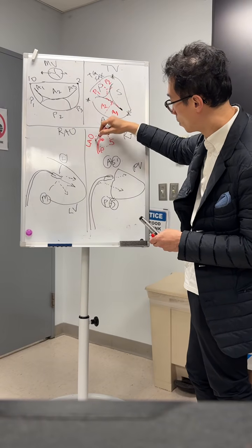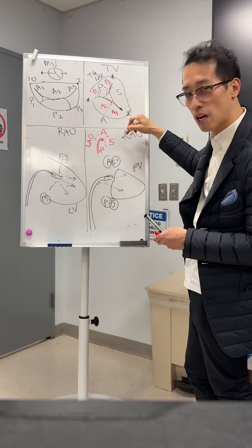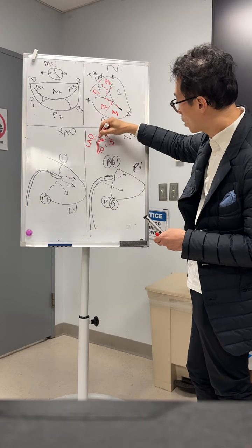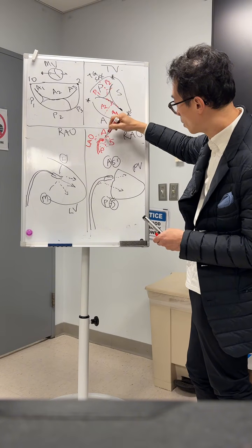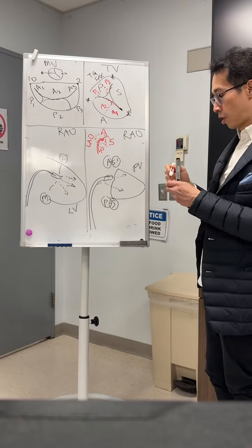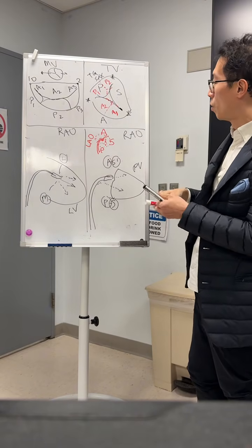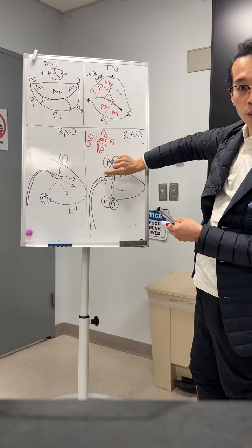This is your valve now, right? So septal is here, obviously, because that's the left heart, right? A is going to be here, somewhere like this. Okay. So when it's LAO, your clip should be more or less like this. So that makes sense, right?